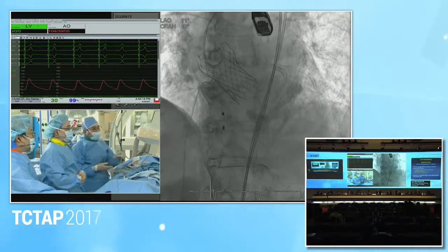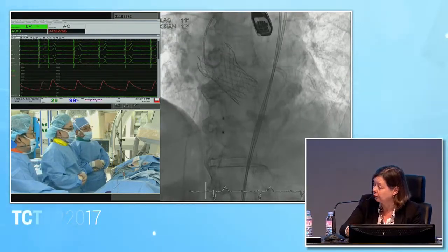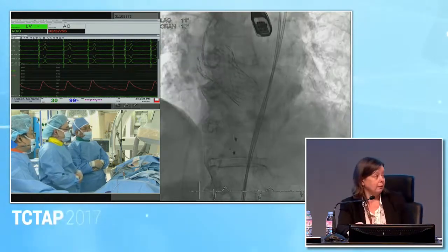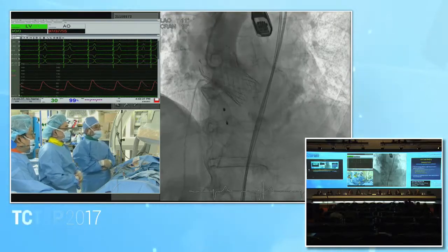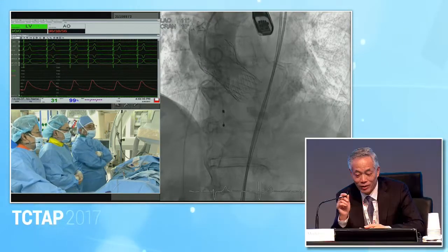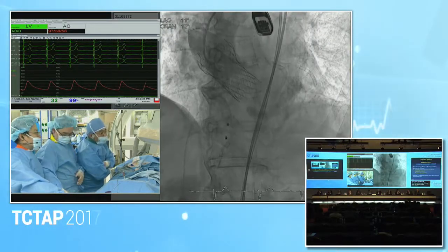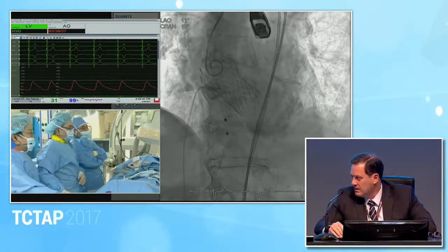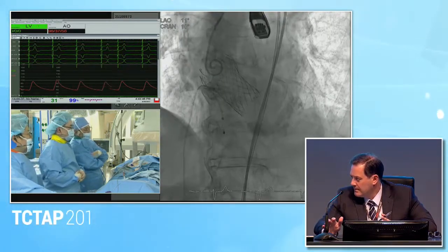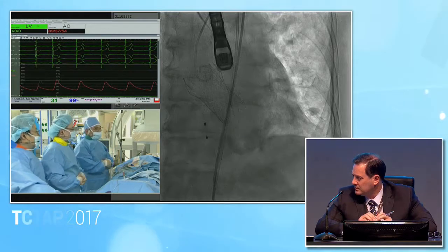I think he will get a pacemaker, no? Yeah. Because he had the AV block, yes, as you said, very early. And why wait with a pacing lead for 2 days? Right. For this self-expandable valve, any chance for the recovery? I saw there's a pretty small chance for the AV block with this kind of valve. Yes. Any comments? Yeah, early heart block like that almost always results in a pacemaker. And if you follow these patients up, a lot of them are not using their pacemaker down the track. But it's impossible to predict. So you find yourself implanting pacemakers in these patients. Yes.